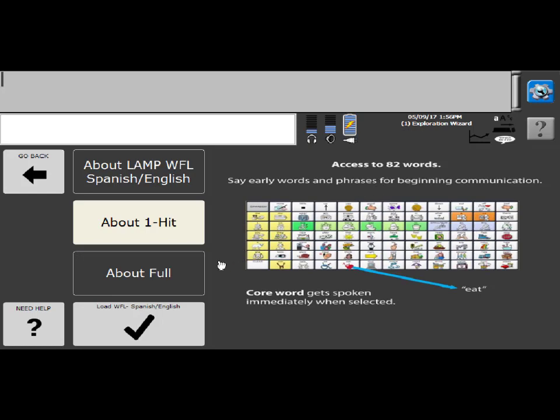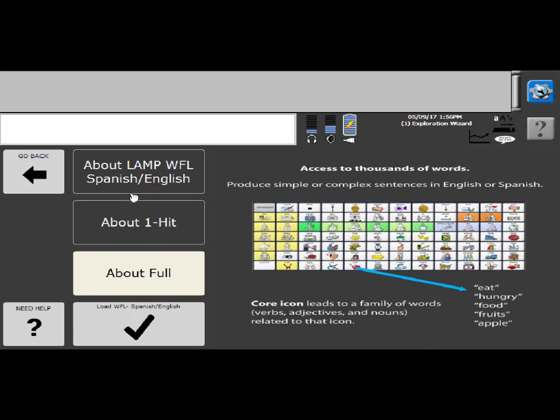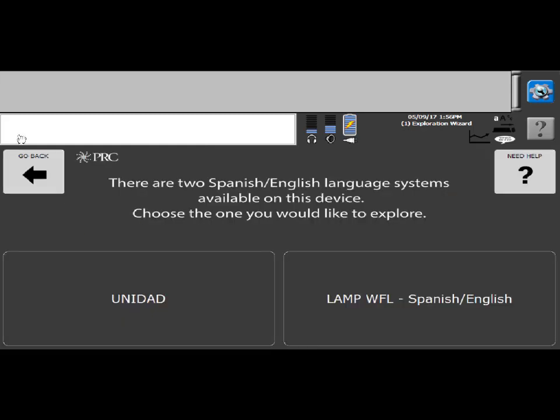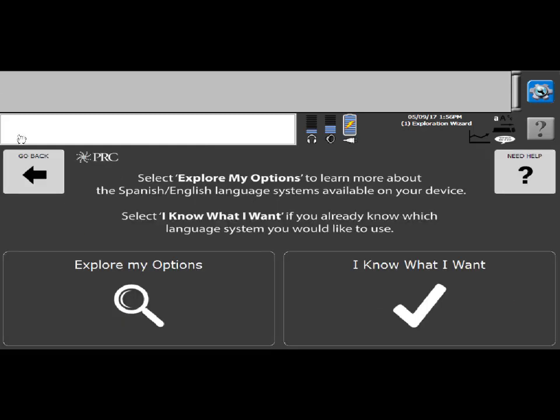And then the full program is access to thousands of words and you can either produce simple or complex utterances. So with that, like I said, with Lamp Words for Life Spanish English, you have the one-hit and the full. Once you know which program you would like to, I'm going to actually back out to here again. You can load it directly from either UNIDAD or Lamp Words for Life, but I'm going to take it here to show you this section of it.